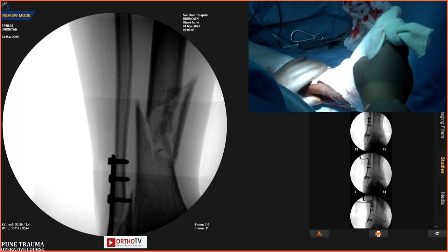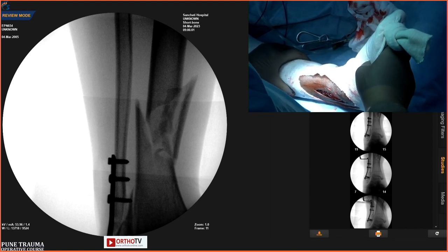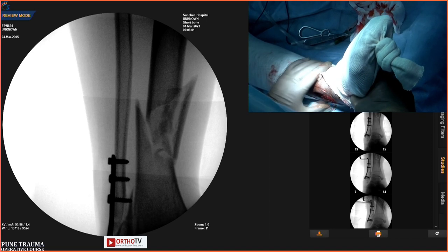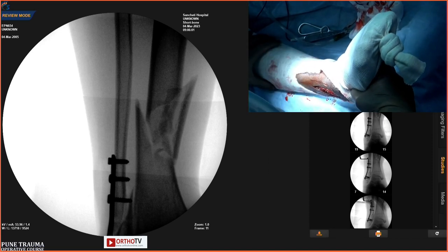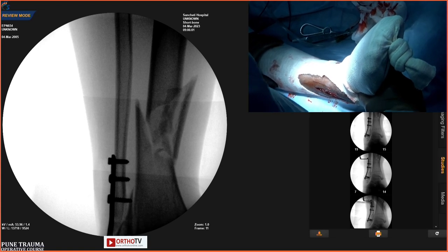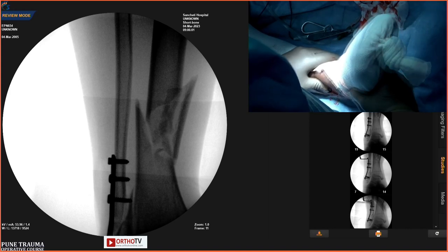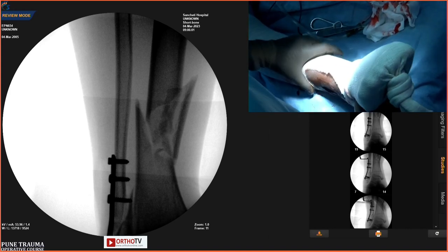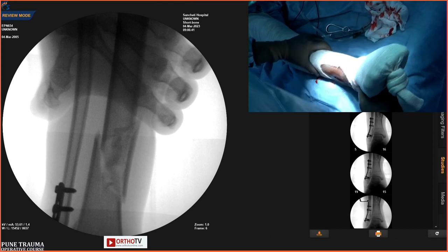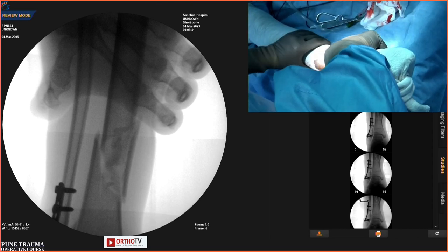I would now use a variable angle fibula LCP, which is there, but this patient, like yesterday, would not be able to afford the Synthes implant. So this dedicated fibula plate tends to go a little more distally with an oblique screw going a little more. So three screws, that's what we should aim for if that's a distal sixth or eighth fibula fracture.